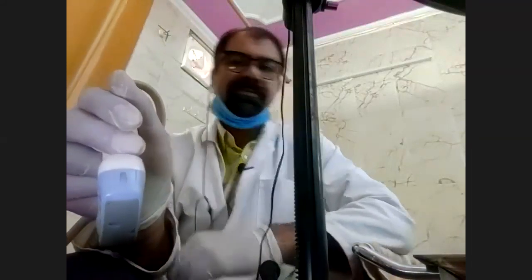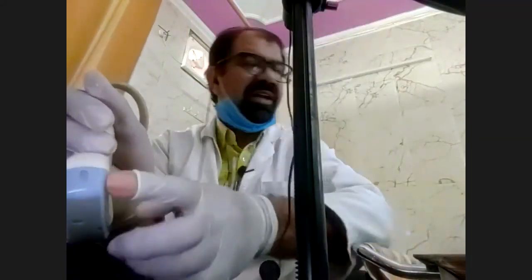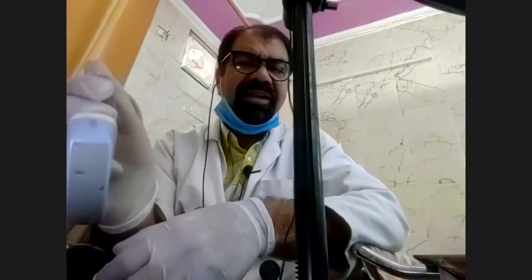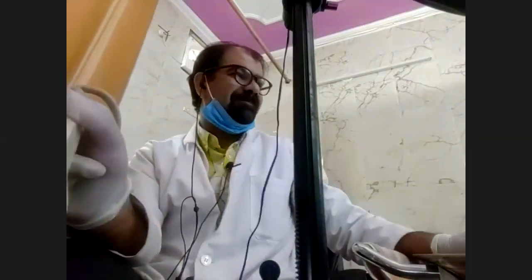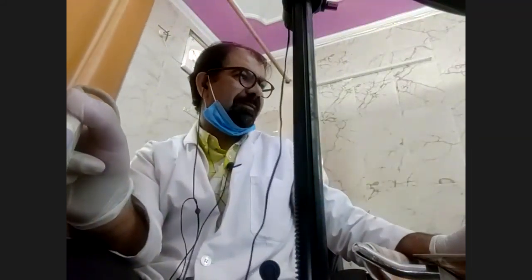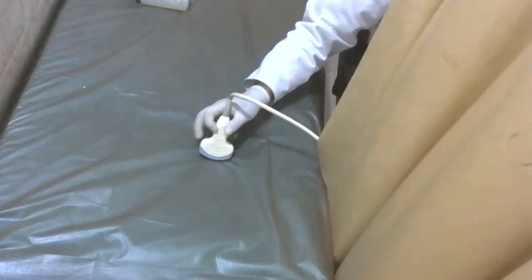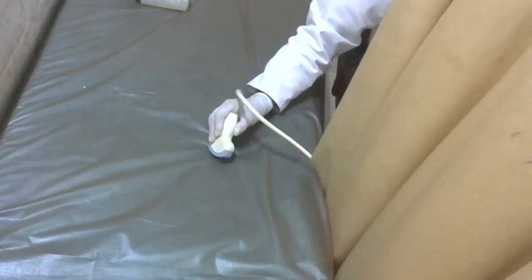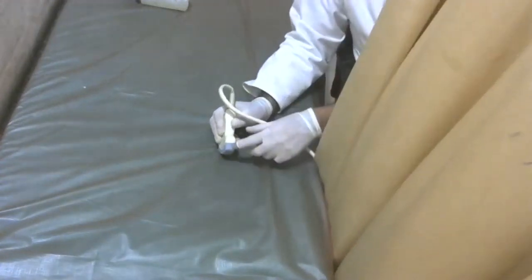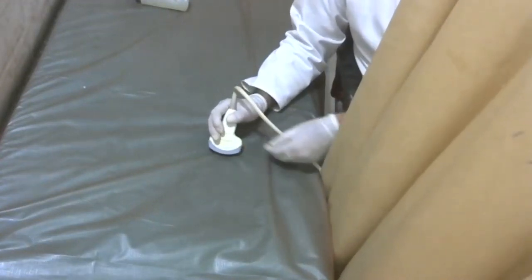Give me the answer. Will this indicator now go towards the patient's head or towards the patient's feet if I rotate it clockwise? Now see here. Can you see the bed now? Now this is the transverse section, right? And in this transverse section, this indicator is over here. It means that this indicator is towards the patient's right.